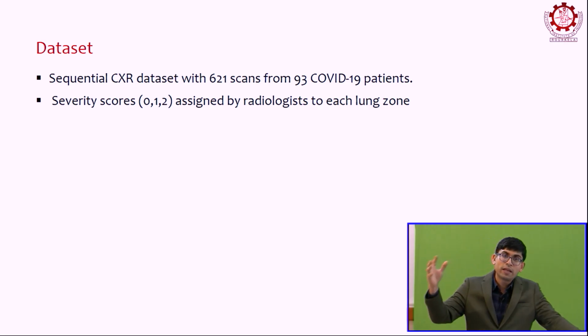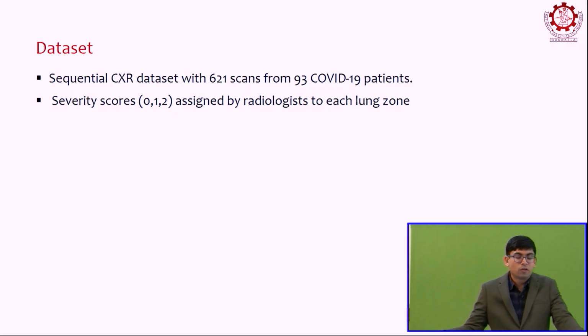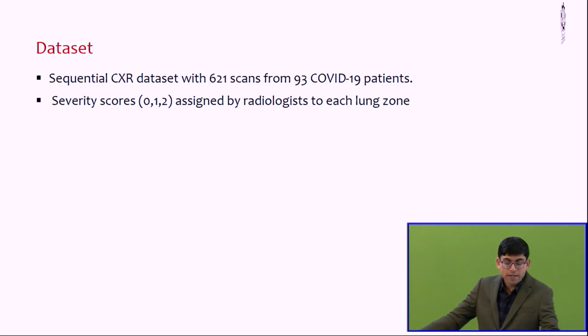If you further scrape that image, there's so much loss of information. You lose maybe 90% of it, and you try to train a machine learning model with that quality of image. Obviously, like I said, garbage in is garbage out, right? So most likely those models don't even mean anything. That's why we have to be very careful in the way we collect and curate our images.